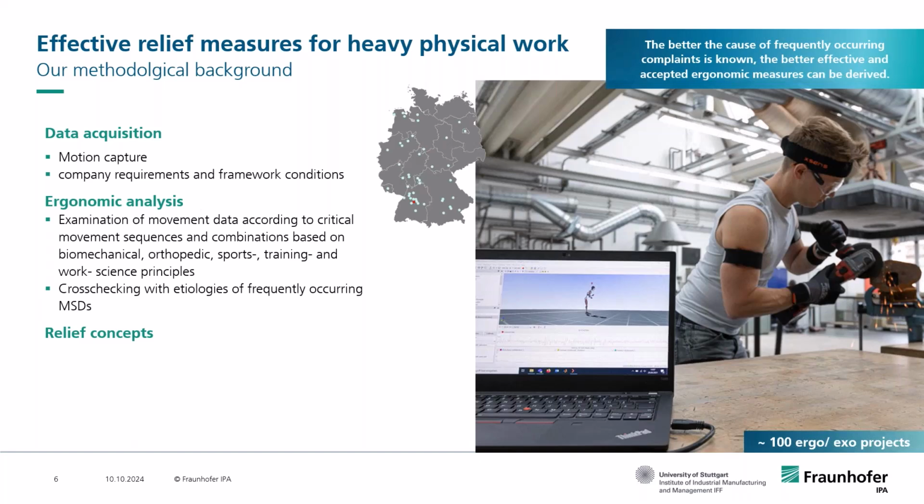You look at the times of people being in bad postures in different parts of the body, for example, the trunk, and in the end, you add up all the times, which gives you a value for the posture index. You will do the same for loads and perhaps repetitions, and in the end, you will use a mathematical formula to get an ergonomic risk score.